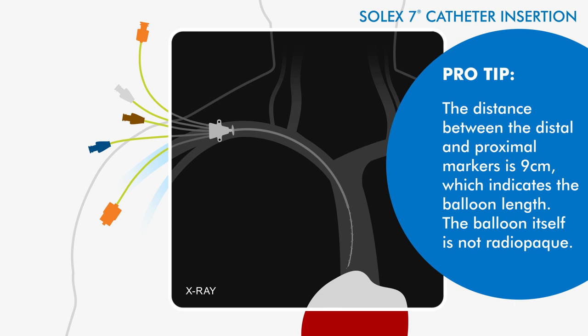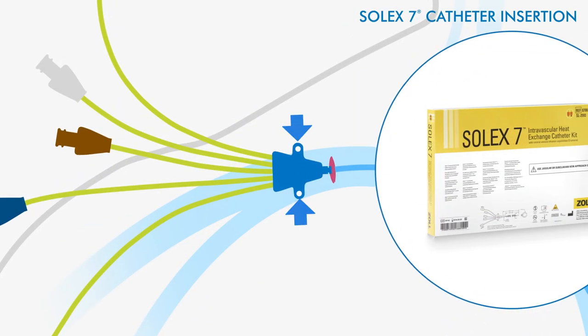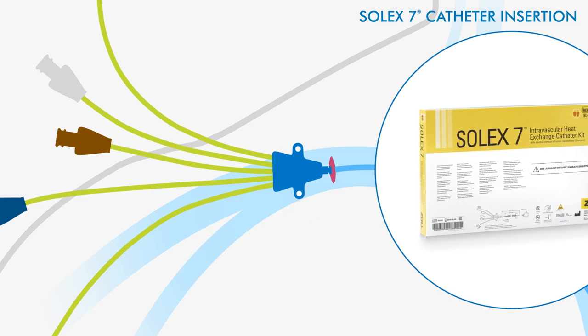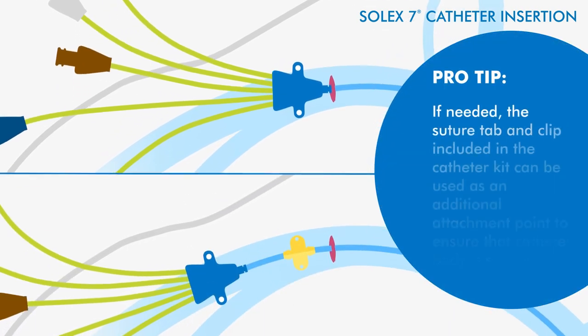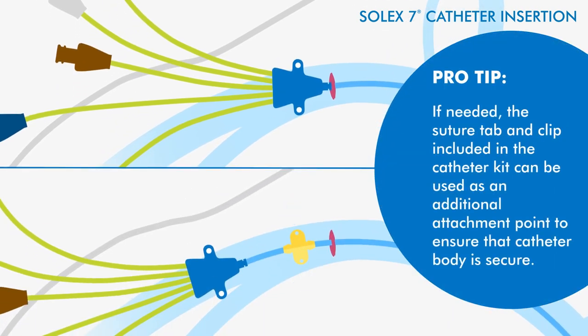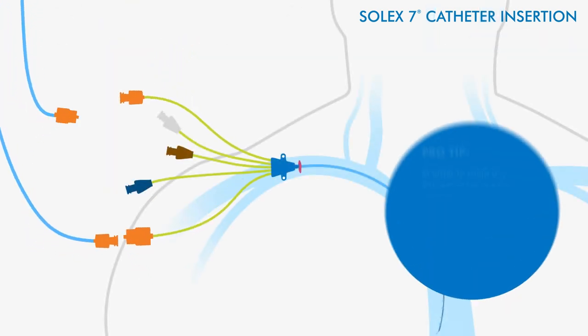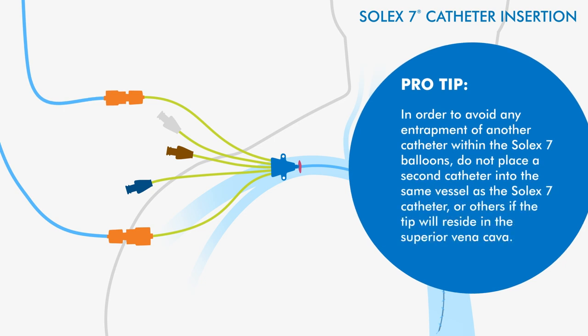Once catheter placement is confirmed, secure the catheter to the patient by suturing the side wings. If needed, the suture tab and clip included in the catheter kit can be used as an additional attachment point to ensure that the catheter body is secure. Connect the catheter to the startup kit lumens and enable therapy as instructed by the console.